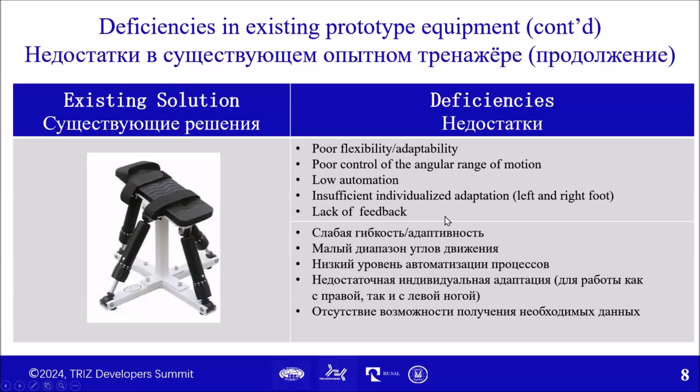The simple device rehabilitation has the following disadvantages. Poor flexibility, poor control of angular range of motion, low automation, insufficient individual adaptation, lack of feedback.